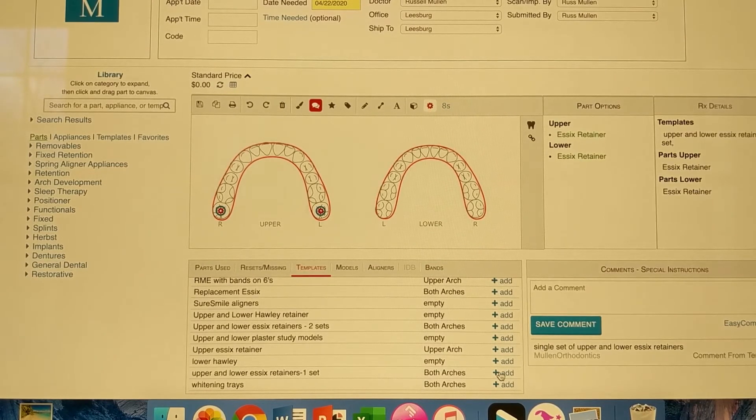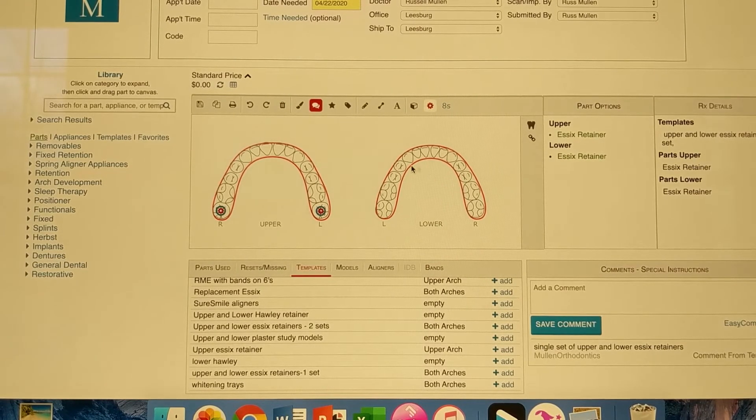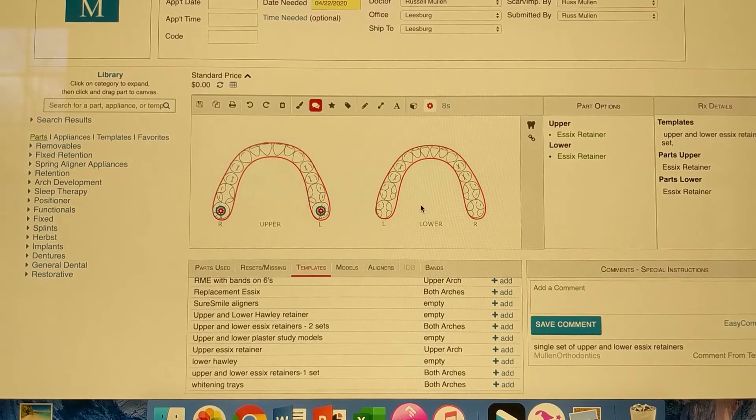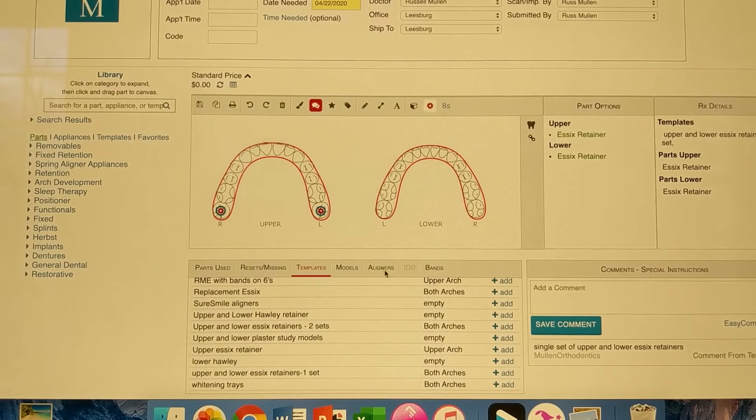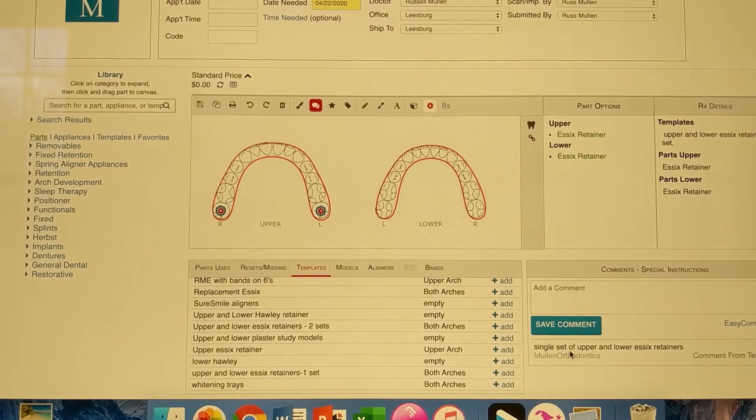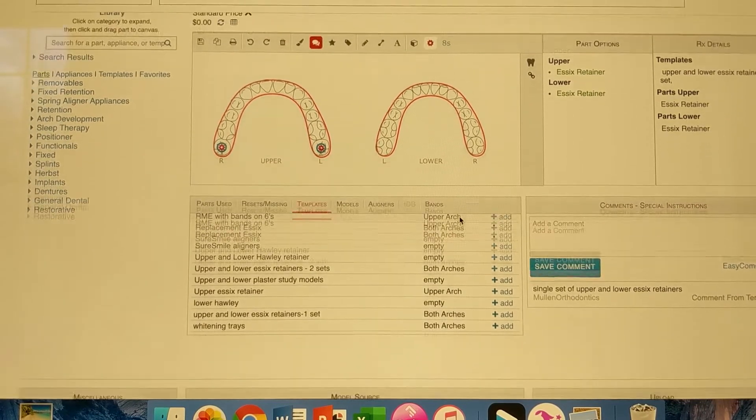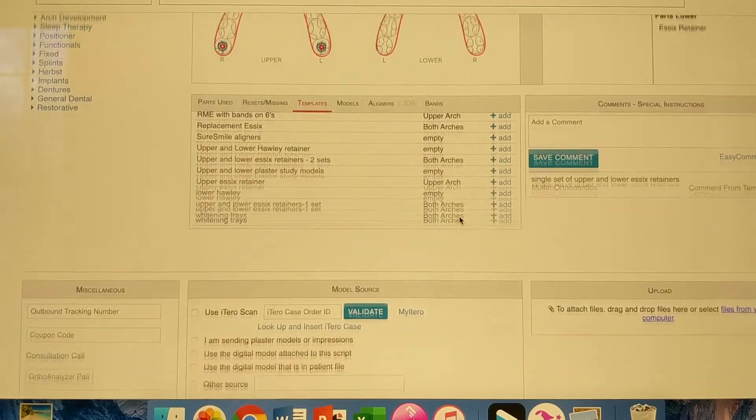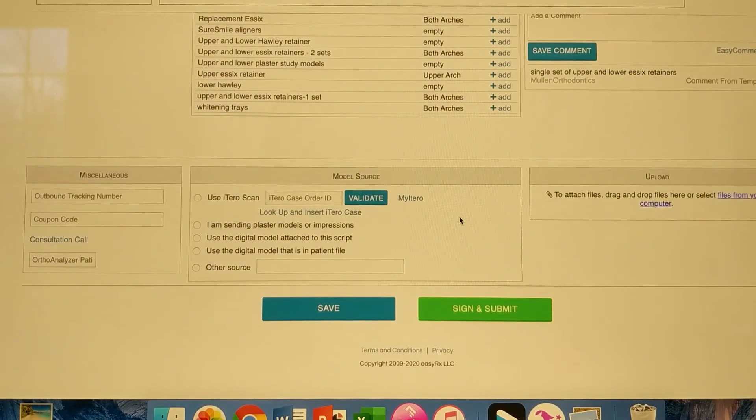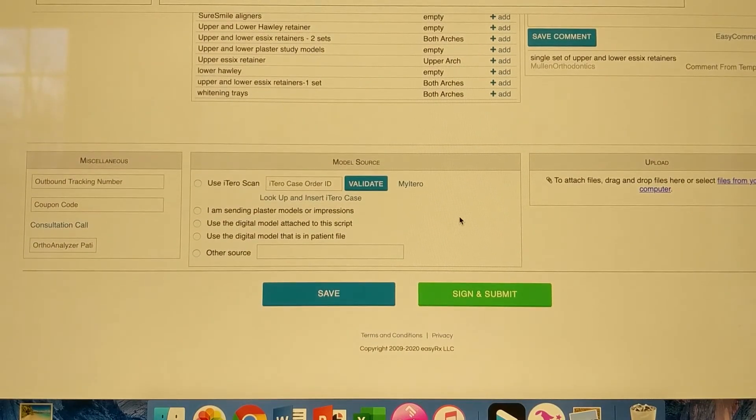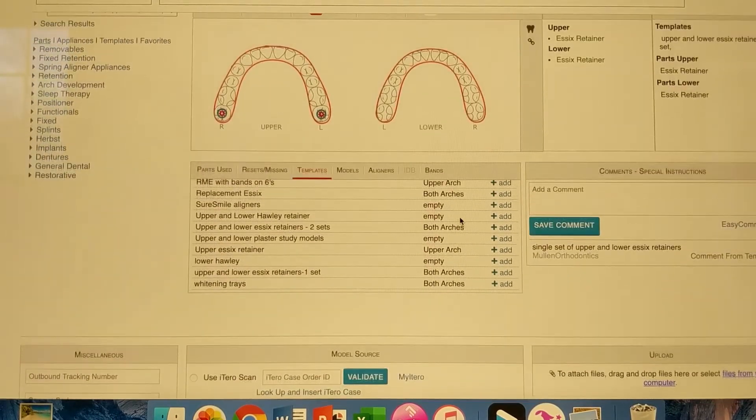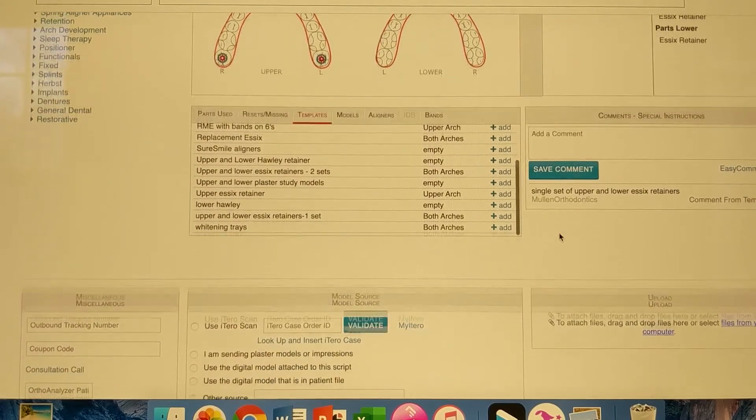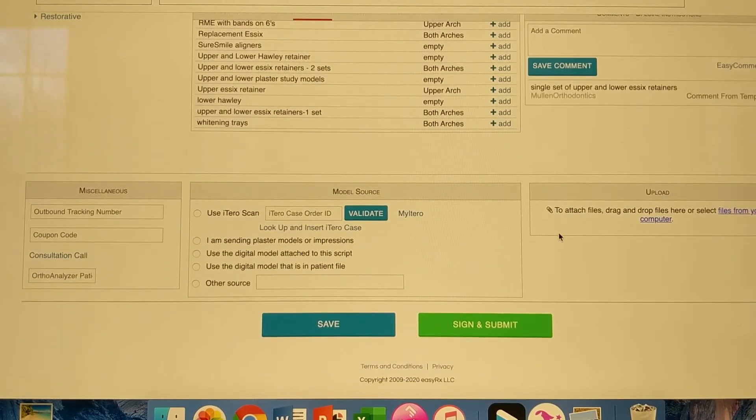And this is what pops up. This is something that we've generated in our office. So here are the instructions to the lab. Single set of upper and lower Essex retainers. And good. So now I scroll down on the whole page.